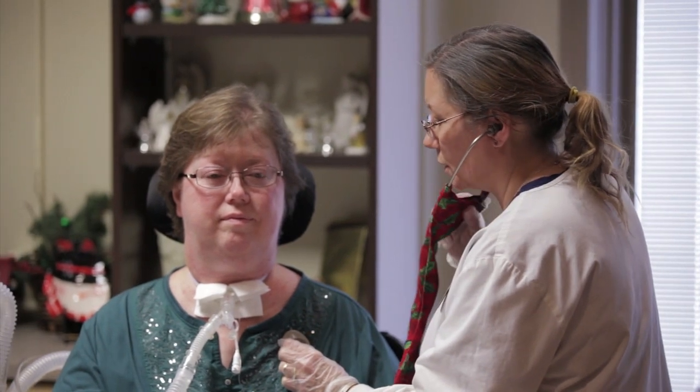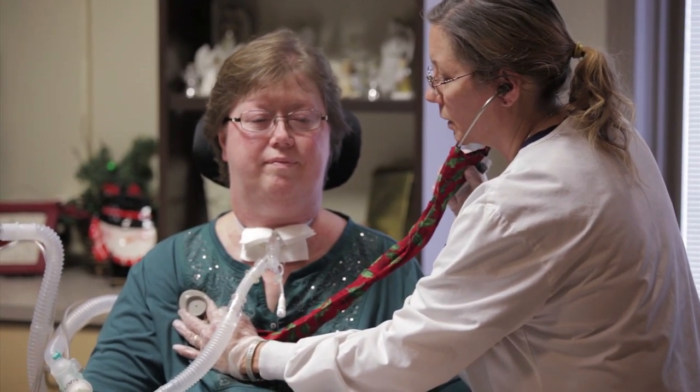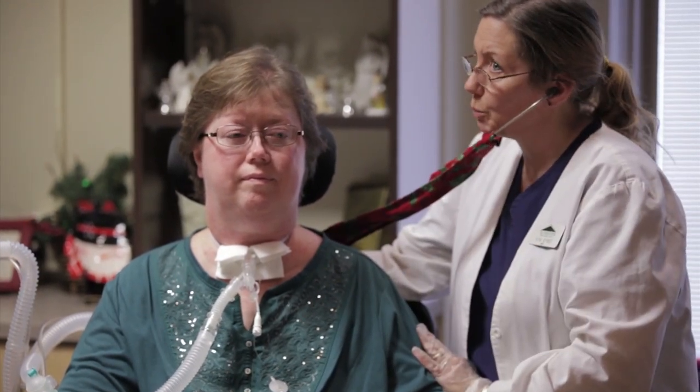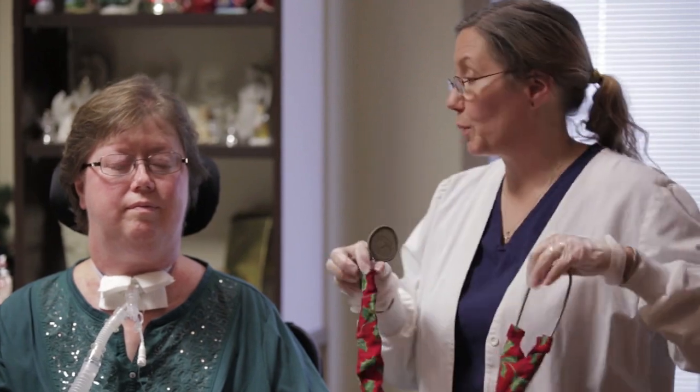I'm going to suction before I deflate your cuff, just to make sure there aren't any secretions laying underneath. When I drop that cuff, there may be some secretions on top of the cuff that may slide by. You may feel them slide down and you may need to cough — and that's all natural.